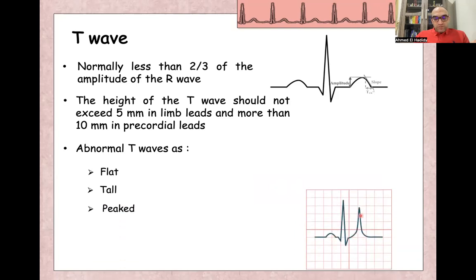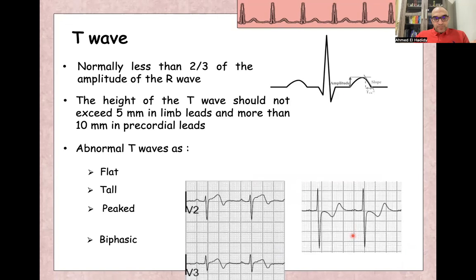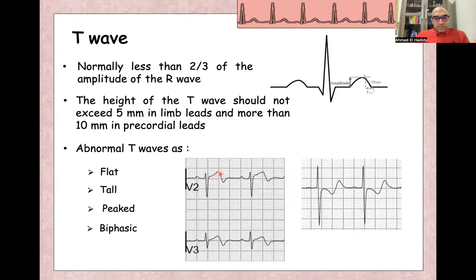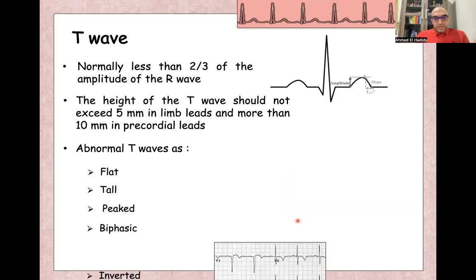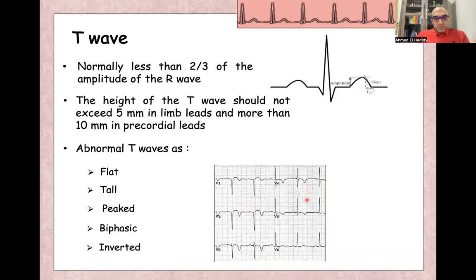Peaked T wave, what we call peaked or tented T wave is abnormal. Biphasic T wave, like this example, like in V2 and V3, this is biphasic T wave. Either first deflection is positive and second one is negative, or first is negative and second one is positive. Both are abnormal and also inverted T waves is also abnormal T waves.